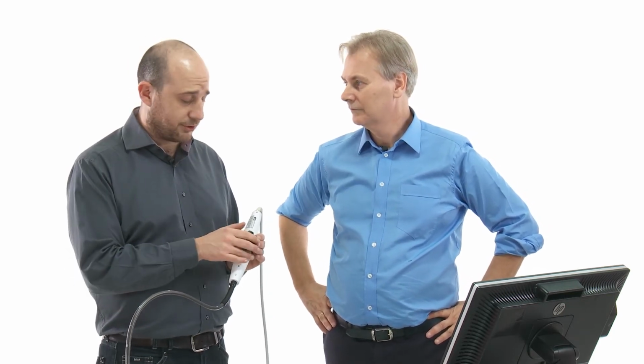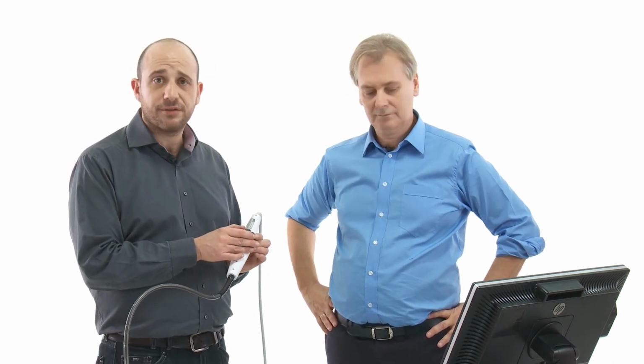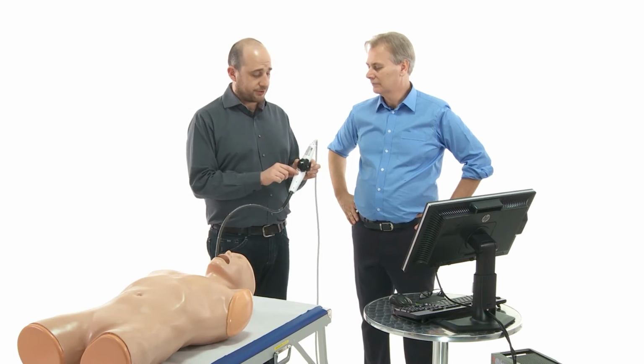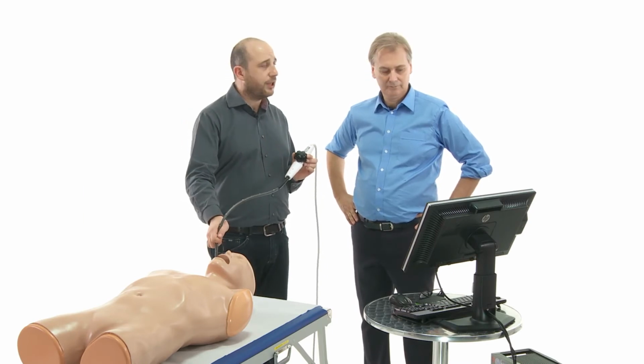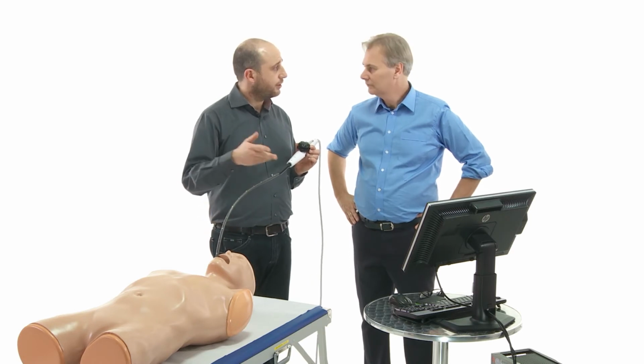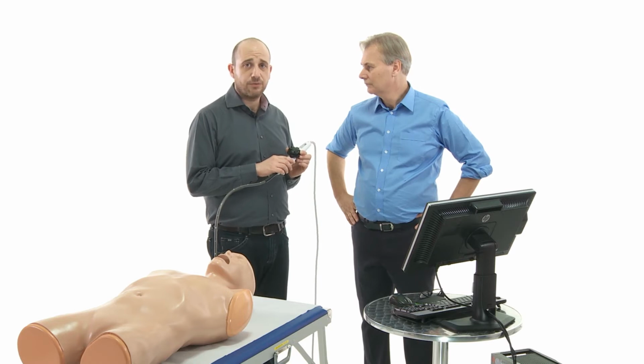Sometimes you don't need the left flexion at all, but at the beginning it's very nice to always use it for the first times. Then, as soon as you turn the 2 wheels, you can slowly pull out the probe till you see the deep transgastric view.